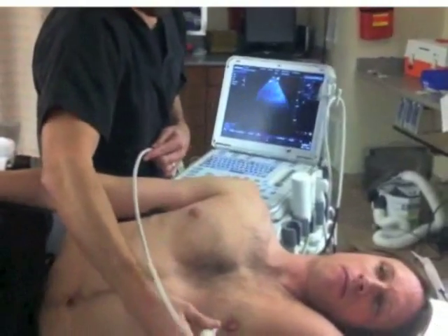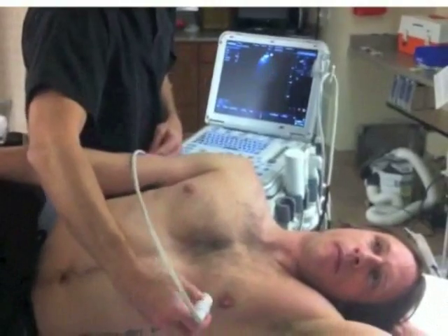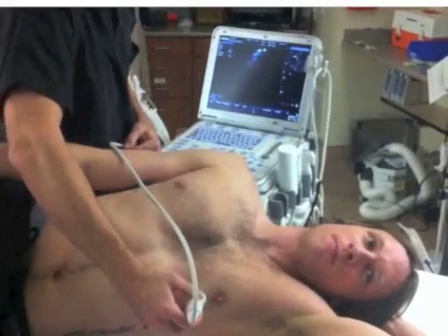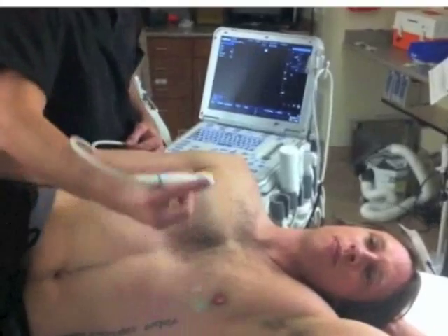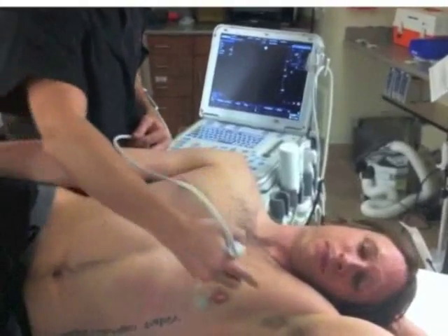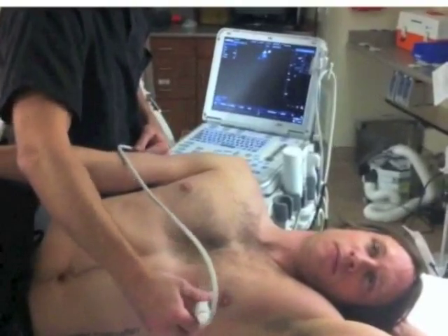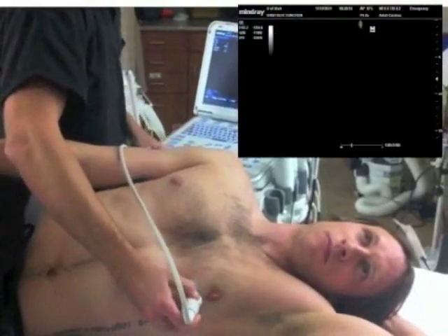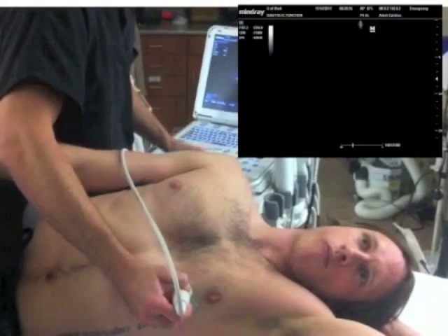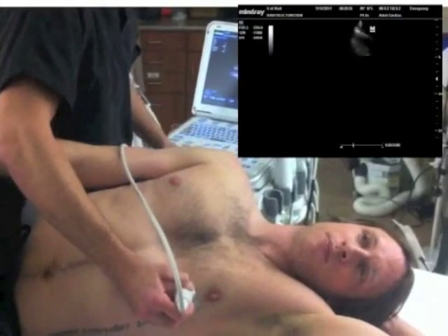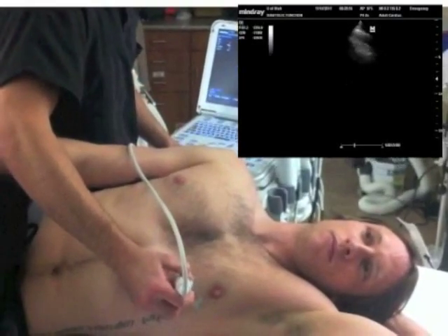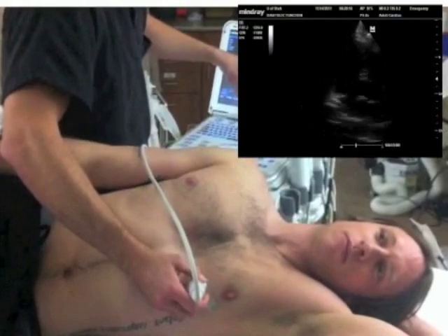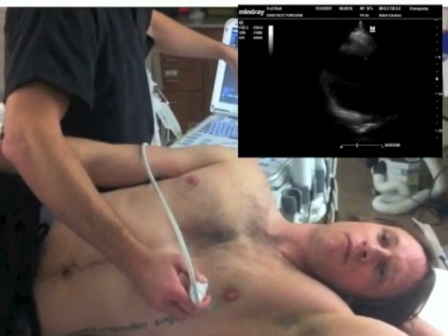So we're going to get started looking for the apical 4-chamber window here on Phil's chest, just going right below the nipple. I usually take the probe marker, point it towards the back of the left axilla or either down to the bed. And when I do that, you usually have to move around a little bit to find the right intercostal space.